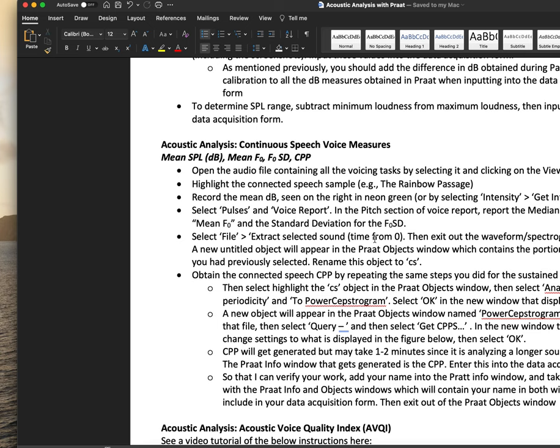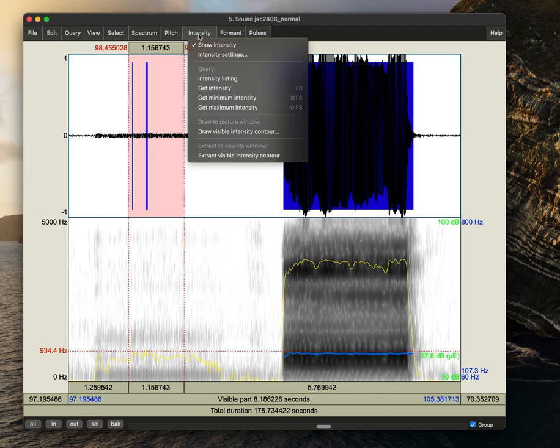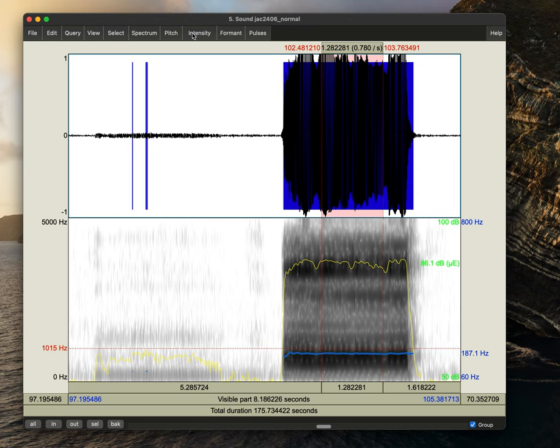OK, so the first thing that we'll do just like we did with the pitch is look at the average minimum intensity and maximum intensity. So here we can see that it's 57.8. If I wanted to use this because that might be hard to see, we would go to intensity, get intensity and we again see it's 57.8.